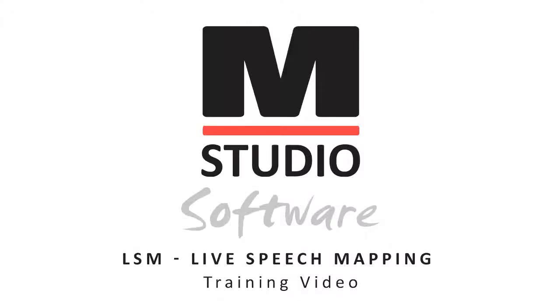In this video we will review live speech mapping and how to perform live speech mapping measurements within the Medrex Studio software.